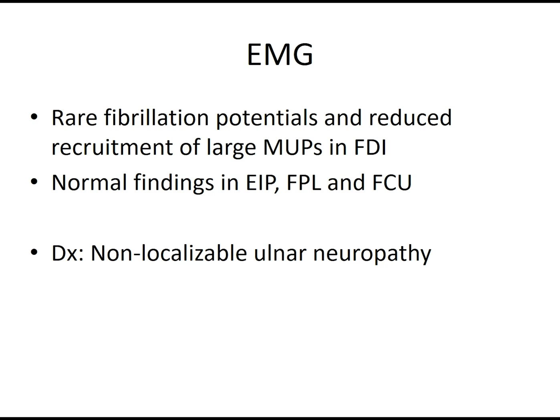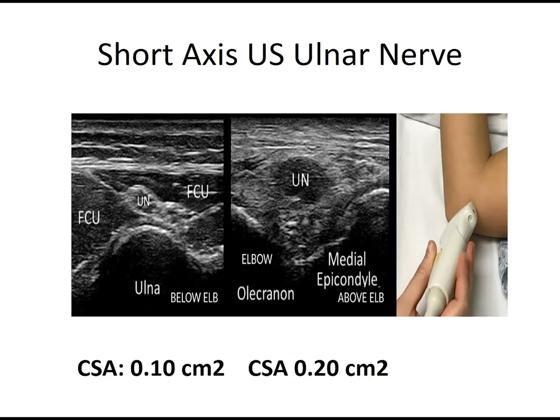So the EMG diagnosis was a non-localizable ulnar neuropathy, hence we elected to perform ultrasound. On the left here you can see the ulnar nerve sitting beneath the aponeurosis that forms between the two heads of the flexor carpi ulnaris muscles.